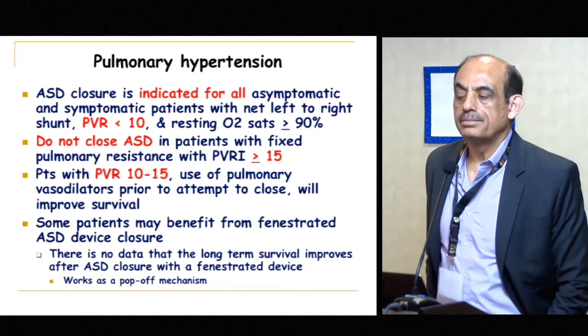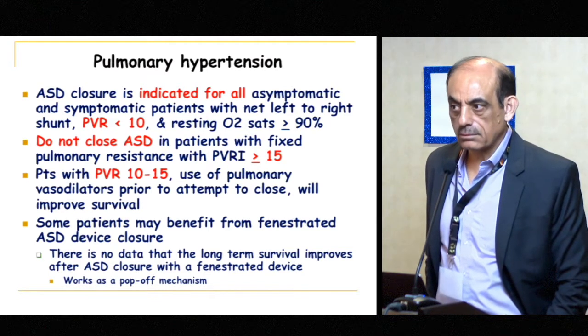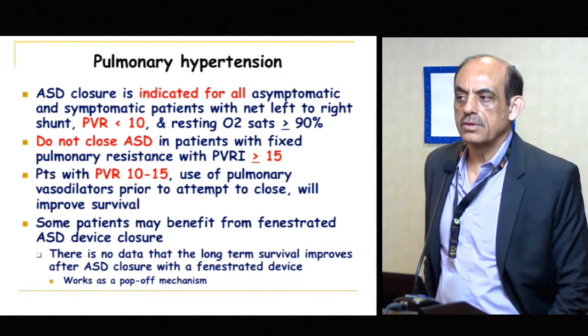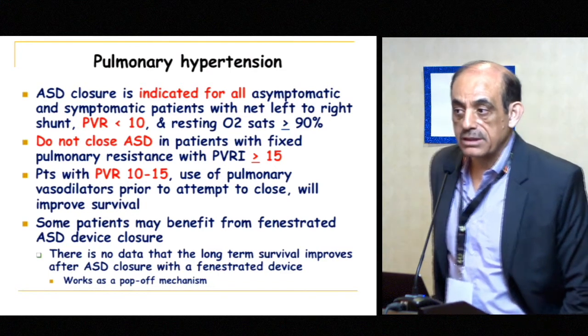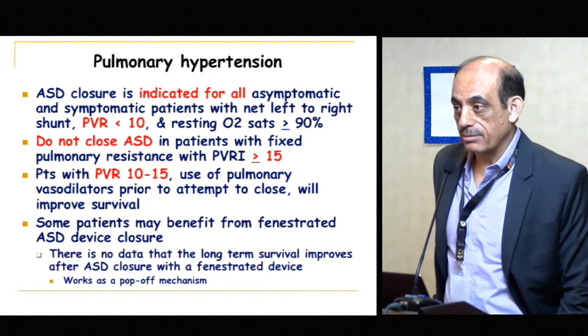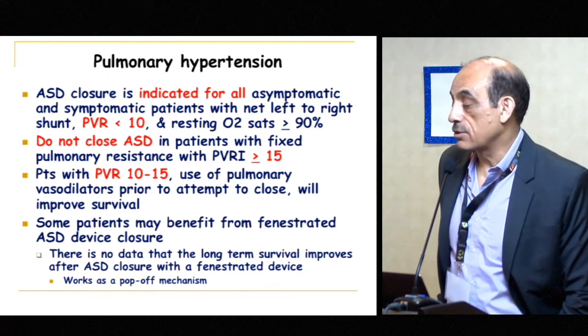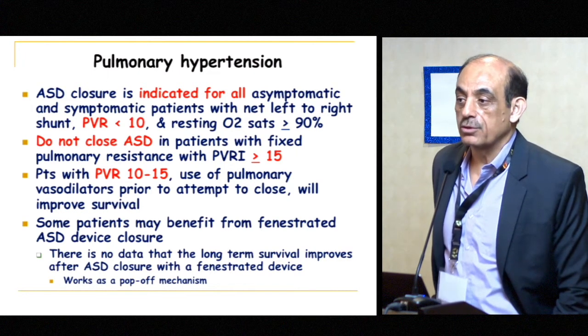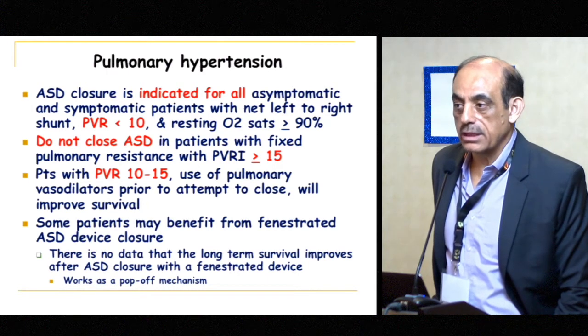So I don't think TE probe, personally, I think it can work against you when you're trying to do ASD sizing in small kids. I completely agree with you, and I've seen that. We use ICE catheter sometimes, actually. In the smaller babies, 2-3 kilo, we use ICE catheter. Actually, it's much simpler to put through in the esophagus and then do close ASDs as well.